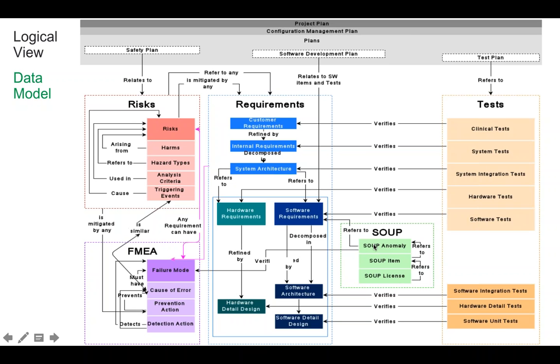And as you can see here as well, there is another connection. It might as well lead to a failure mode. And for sure, you have to check that because your security and safety aspects of what you have might be affected out of that.